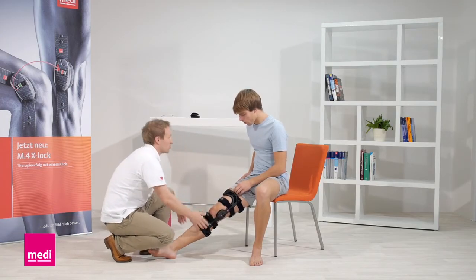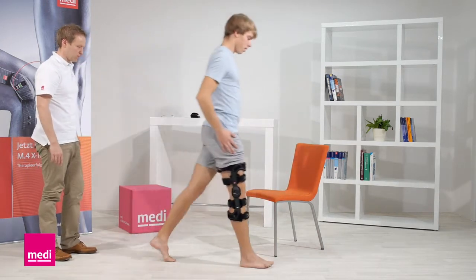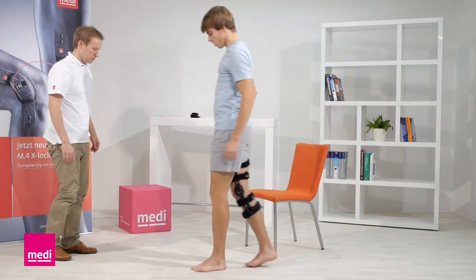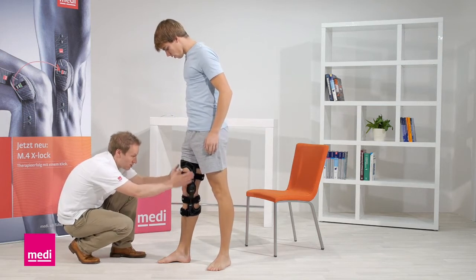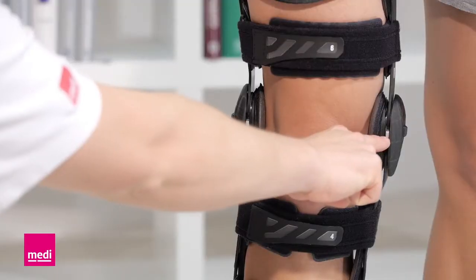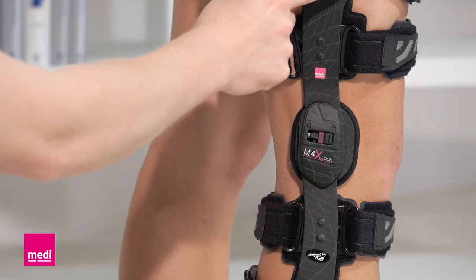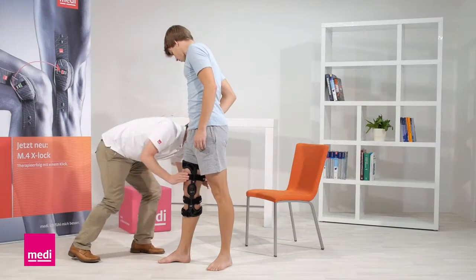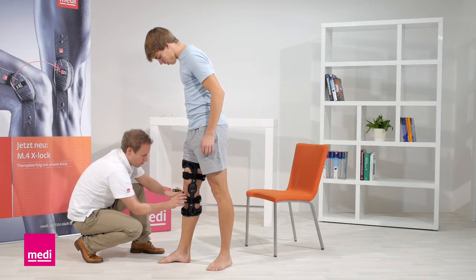It is now recommended to walk a few steps and check again that the orthosis fits properly. As you can see, the middle of the orthosis hinge should be positioned at the level of the superior border of the kneecap and behind the lateral medial midline of the leg. Then pull the straps tight again in the same order to prevent the orthosis slipping.